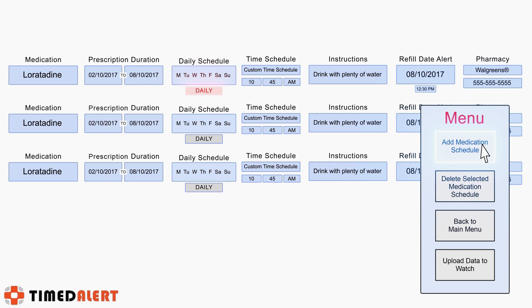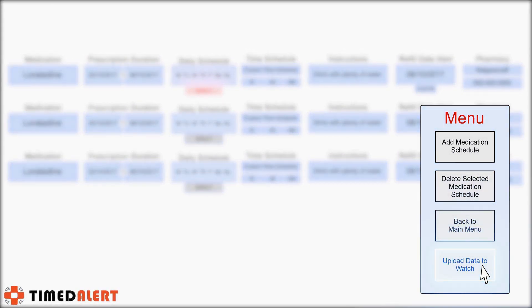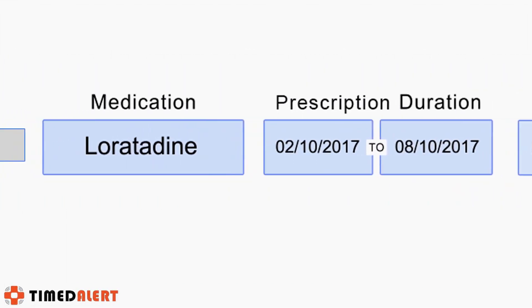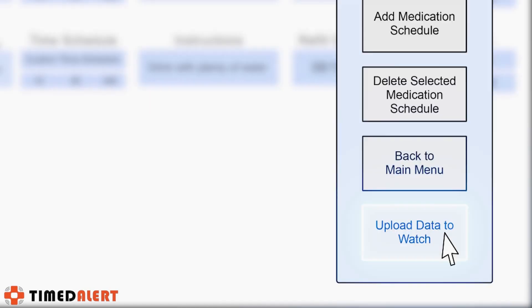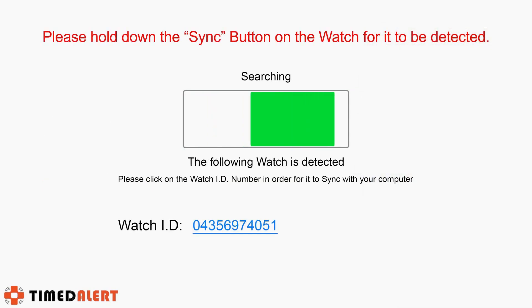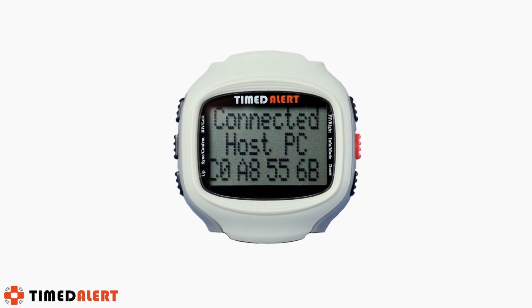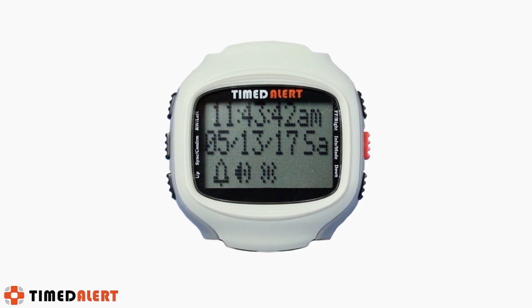Once you have created your desired number of medication schedules, you can upload the data to the watch by following similar steps as previously done. First, select the medication schedule that you would like the watch to have by clicking the checkbox to the left of the schedules you wish to upload. Then click the upload data to watch button, remember to press and hold the sync button for three seconds, wait for the ID number to appear, and click on it to upload the schedule data to the watch. With the new data successfully uploaded, you can return to the main menu.